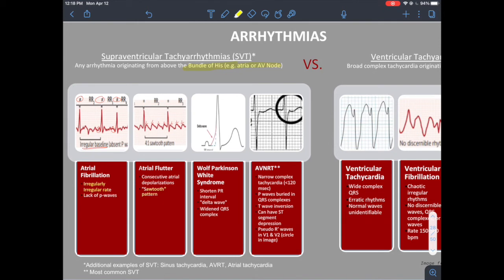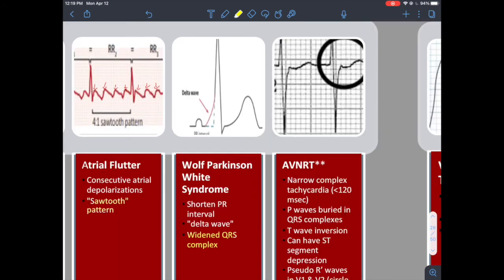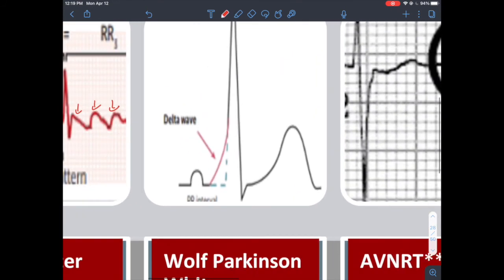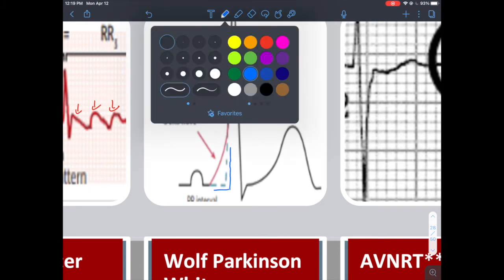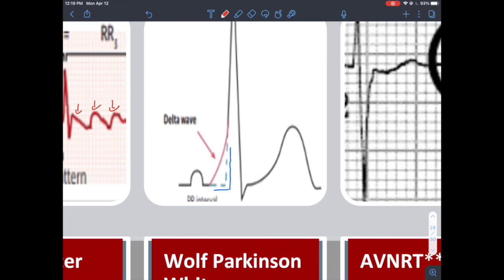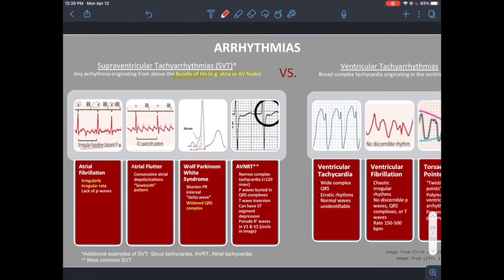Wolf-Parkinson-White: the two key features are a shortened PR interval and a wide complex QRS. Because there is an additional accessory pathway, there's what they call the delta wave, which shortens the PR interval. The QRS complex appears wide because it starts earlier — the delta wave causes apparent QRS widening. So the delta wave, shortened PR interval, and apparent wide complex QRS are how you spot WPW.